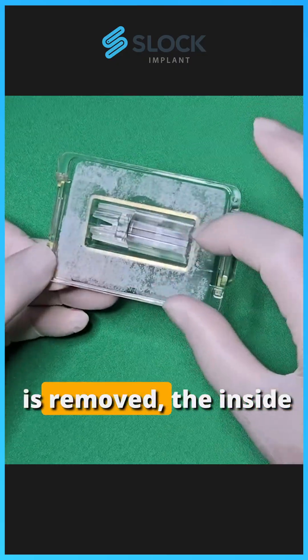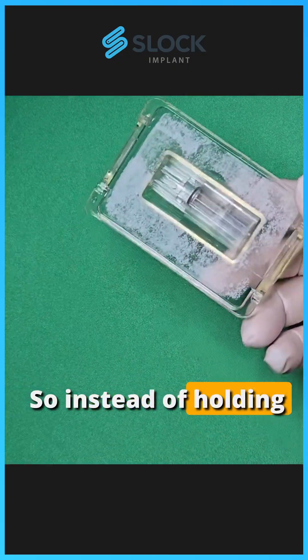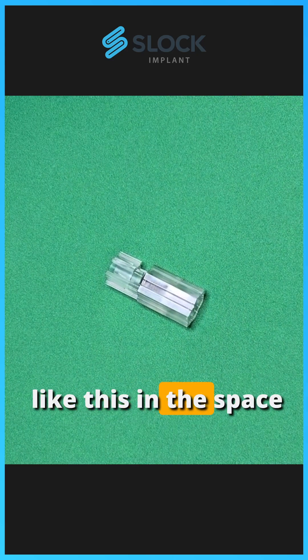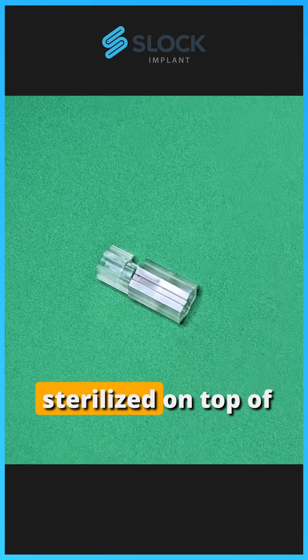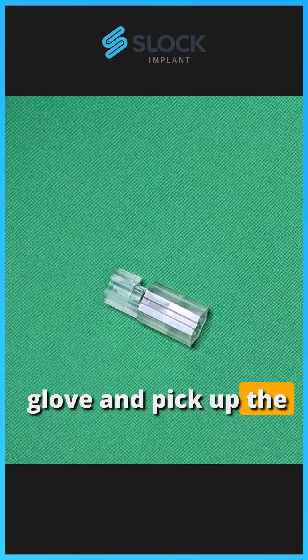Once the Tyvek blister is removed, the inside of this capsule is gamma-ray sterilized. So instead of holding the fixture capsule in your unsterilized hands, you can drop it like this in the space above the drape. And because it's sterilized on top of this drape, I'm going to switch to a sterilized glove and pick up the fixture capsule.